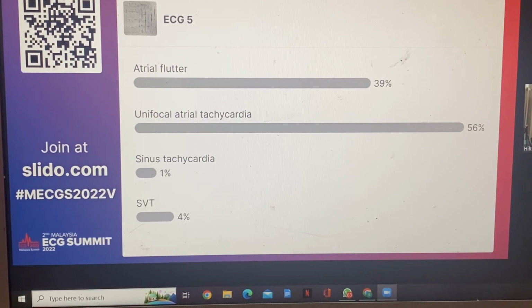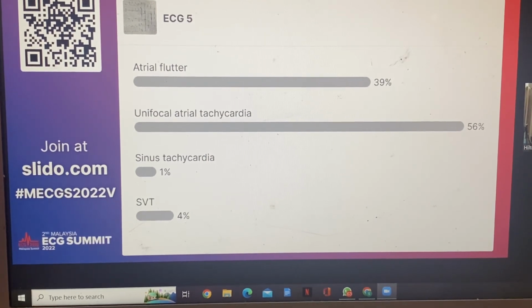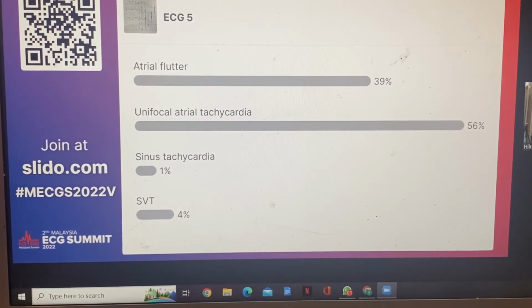Okay, very good. Half of you answered unifocal atrial tachycardia. Very good.